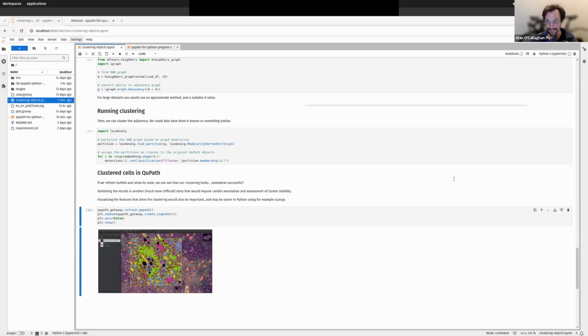I don't know how fun it would be to have multiple things communicating on the same gateway and doing things. Certainly, if you try to send two things at once, bad things might happen. And I think there's probably going to be a trade-off, as you say, between reducing dependency hell in Conda environments and not making a different type of hell for yourself by trying to figure out which Python session the thing that you want to send is in, and all sorts of messiness like that.